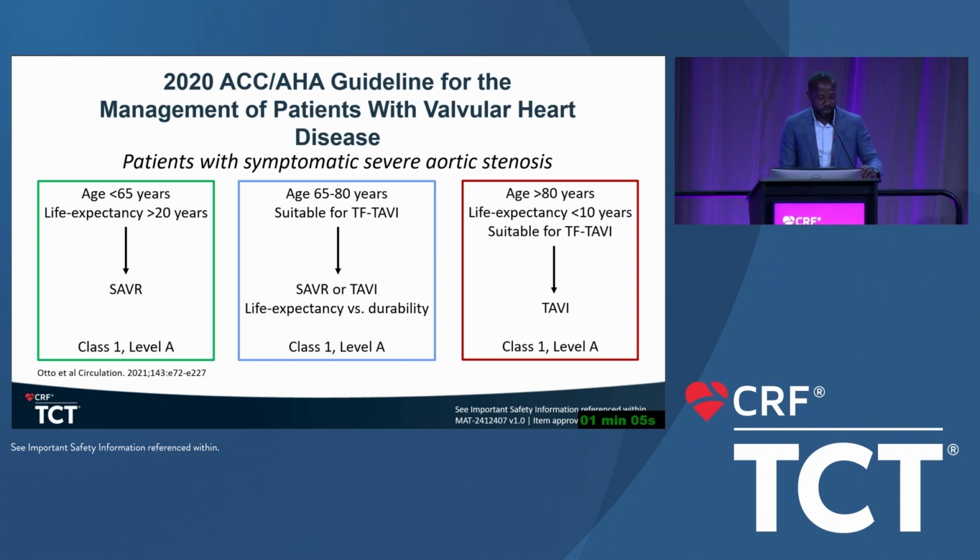Okay, thank you. So I think we come to the end of that symposium. It's been fantastic. We could discuss for hours. What did we learn? We learned that it's very important to put the patient at the center of the discussion. CT assessment has to be very cautious to select the appropriate strategies, even if it is the surgical strategy. Select the appropriate valve to achieve the best hemodynamics, no regurgitation, even mild, and to make sure that you keep the access to the coronary arteries and you don't compromise the redo procedure.